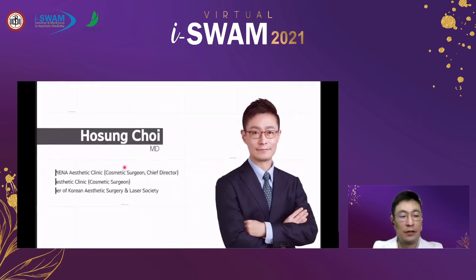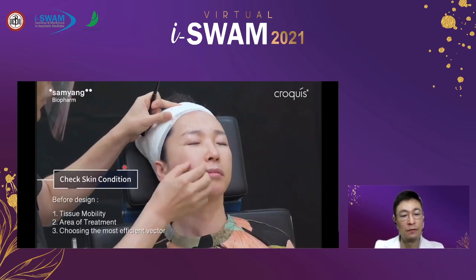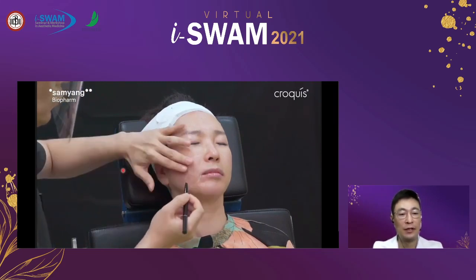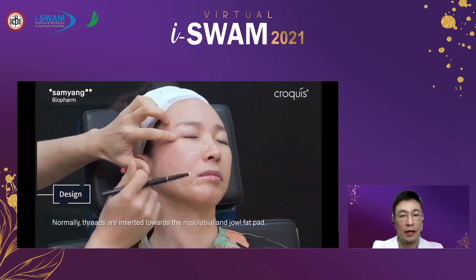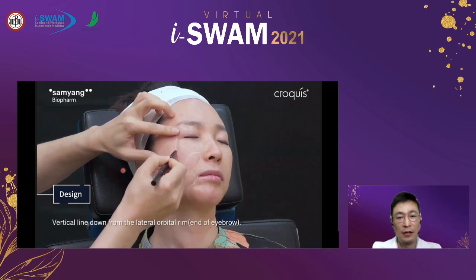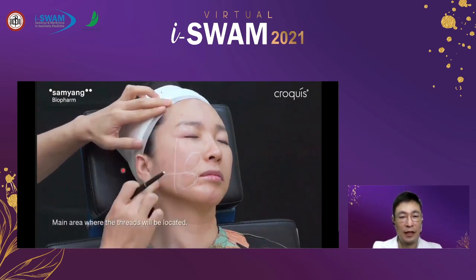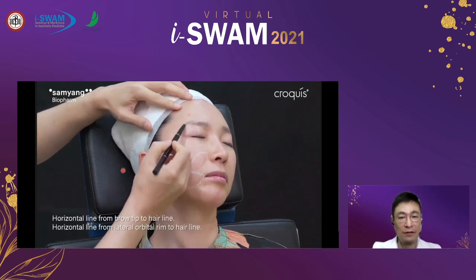Now let's have a look at a short video about lower face lifting using various PDO threads. First, I checked the tissue mobility and asymmetry. Usually the routine is I draw two lines, line C and D, and I choose the area to be treated, to be lifted.